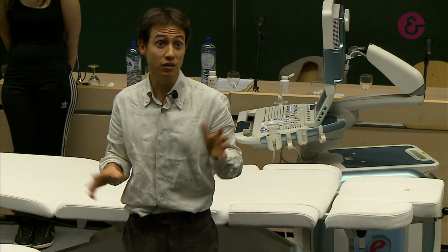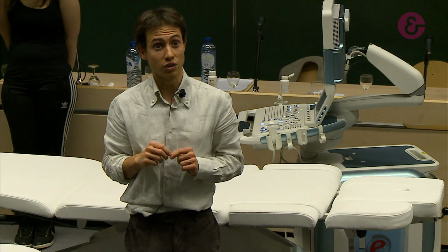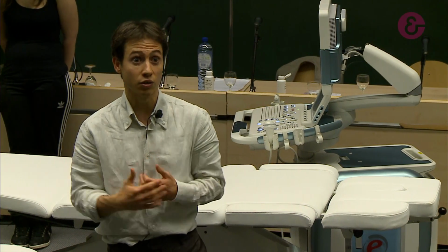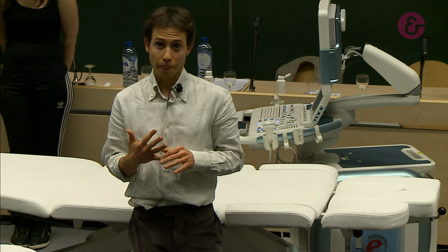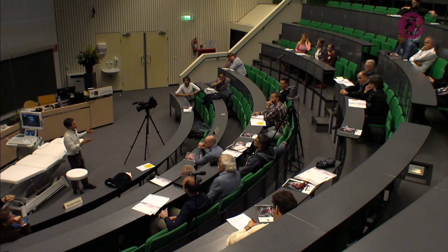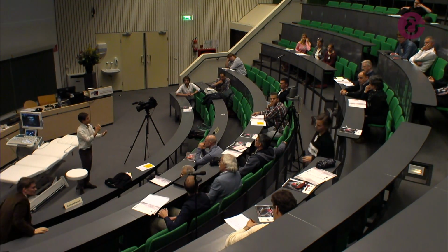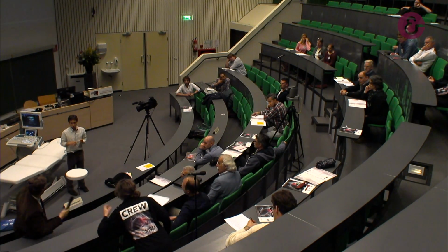If I have MRI, I use the MRI. So I take measurements to see if there is any relation with my clinical examination, for example. And this way I can focus on local muscle, but also superficial muscle if it's in accordance with the clinical examination.